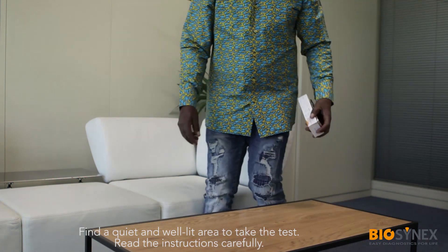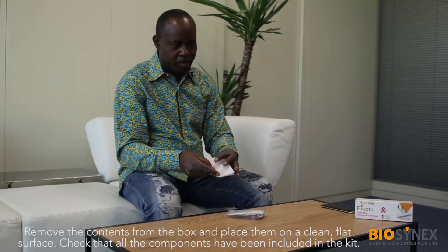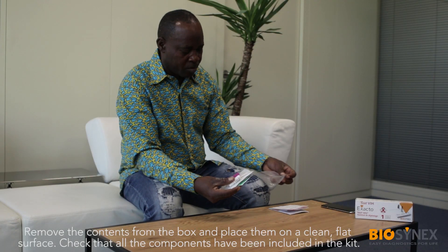Before taking this test, make sure you are in a quiet and well-lit area. Read the instructions carefully, remove the contents from the box and place them on a clean, flat surface. Check that all the components have been included in the kit.